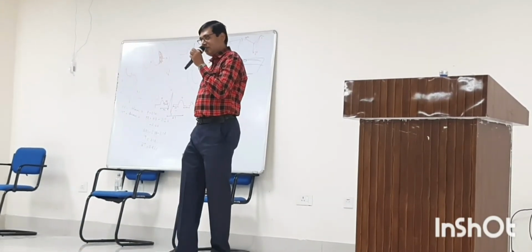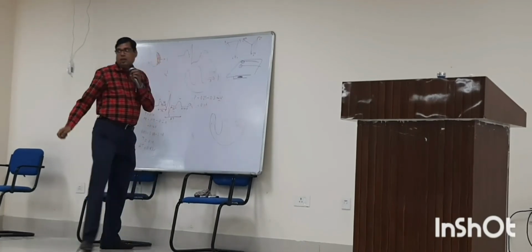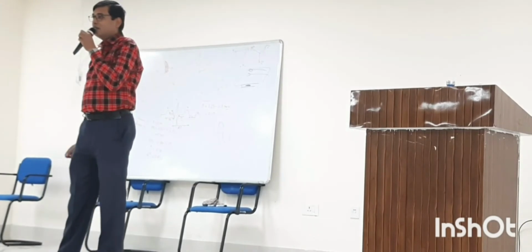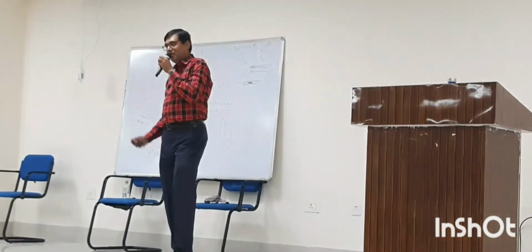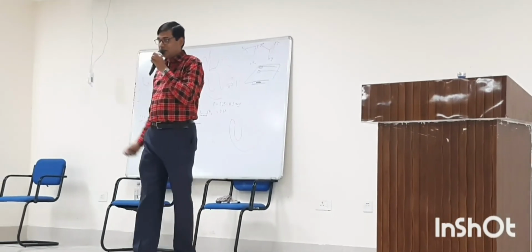In myocardial injury, the direction is reversed. That's why there is T wave inversion in cardiac ischemia. If blood supply is less than adequate, the negative wave goes to the electrode and gives a negative deflection. That is T wave inversion.